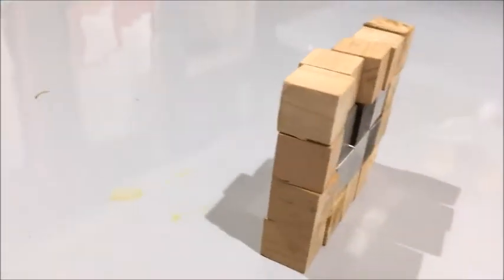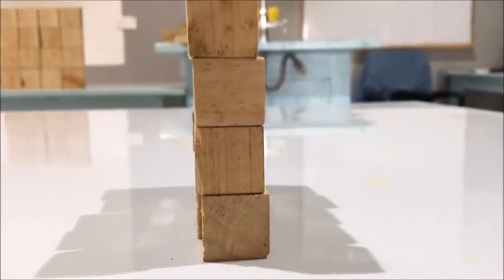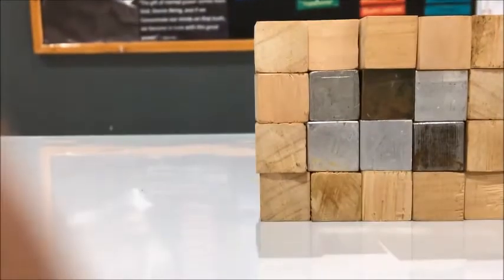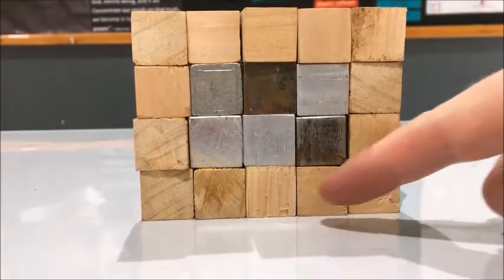So if we went from that end through, maybe it's easier from this side actually, like that, there would be another layer and another layer and another layer, and the whole thing makes up the thumb. And from the end there, I can't see that there's bone in the middle. But if I were to x-ray through this section here, all of that is flesh.